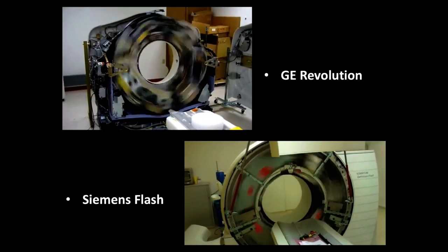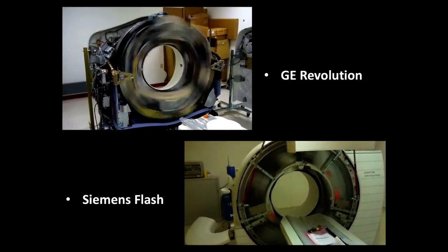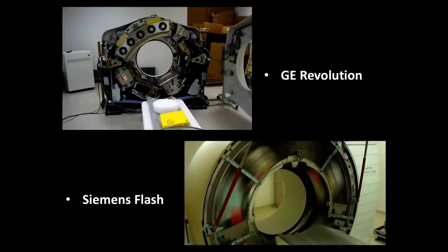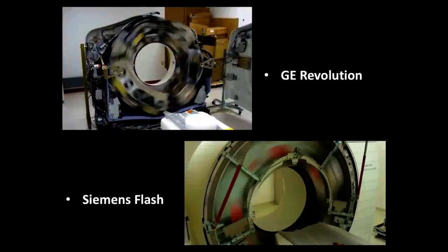So fortunately, there is a cover on them, because I think most patients would be pretty terrified to have to go through one of these. Although it's probably safest to be in the center of these scanners. If anything happened, it's the people around that's going to cause the issue.